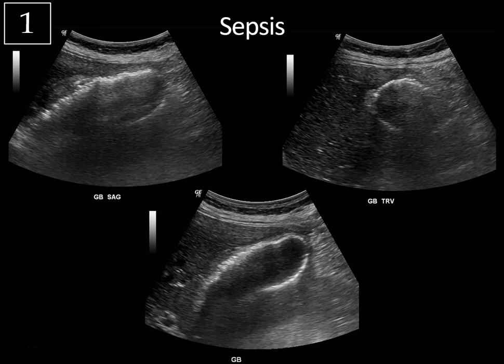So we're looking at sagittal and transverse images of the gallbladder, and notice how echogenic the gallbladder wall is. You might initially think, is this calcification of the gallbladder wall — is this porcelain gallbladder? Well, with calcification, we should have very dark posterior acoustic shadowing, and instead here we have this hazy, dirty shadowing — artifact characteristic of gas within the wall of the gallbladder.